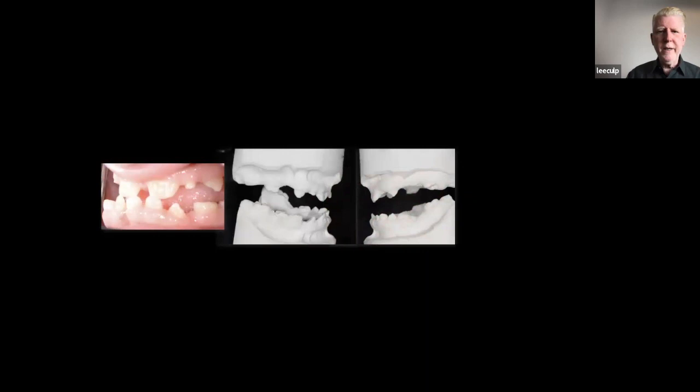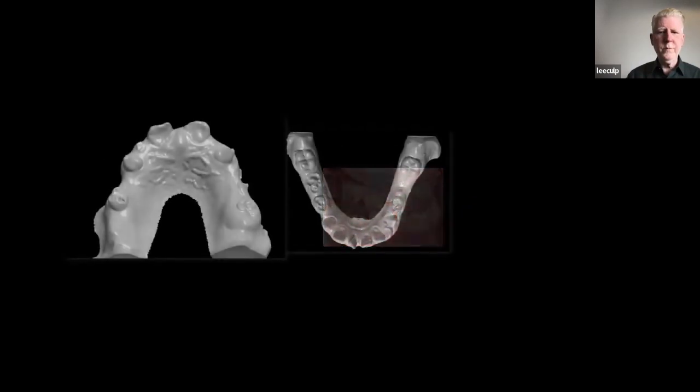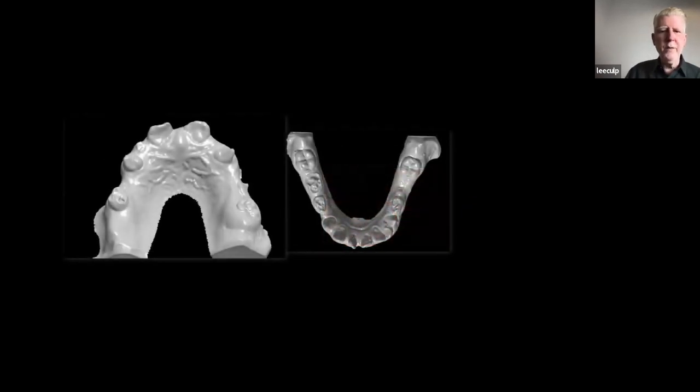So here's our patient. And again, like I said, he had already started the workup, establishing vertical, where the teeth positions go, and already done that in wax. So I kind of had a diagnostic guide to be able to do the digital part when we moved to it. And it looks like this once we started to digitize. And again, we were using models. This is not intraoral scans. We were scanning the models that he had actually started his diagnostics of.